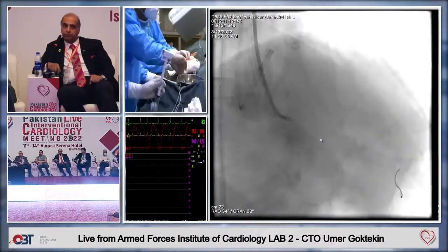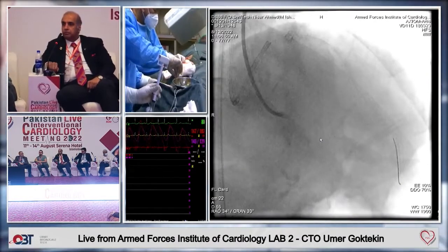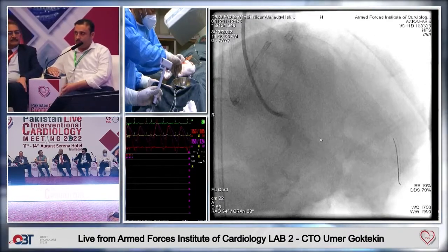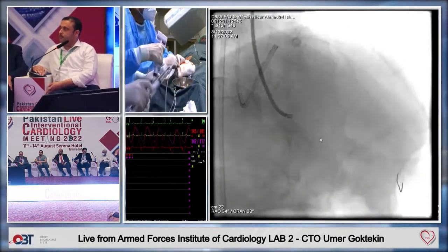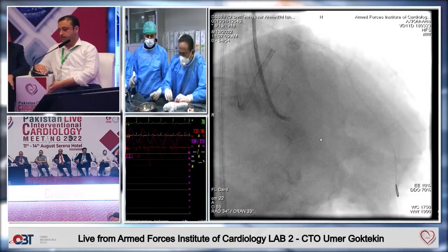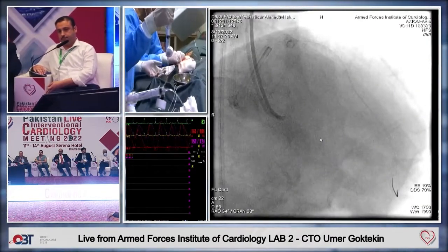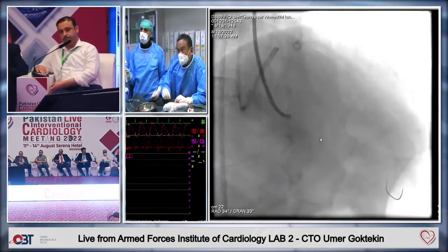Regarding the pricing of microcatheter, how do you compare the Caravel and Fine Cross or Turnpike? Which one is easier to cross with? Like the Fine Cross. Rosalie, they are asking which microcatheter you would prefer and why. You took a Fine Cross, why not anyone else? No, I like to use a Caravel. Caravel here was 150, so I said usually for antegrade we use 135. And when we use a Caravel, the profile is so small, so it's easy.